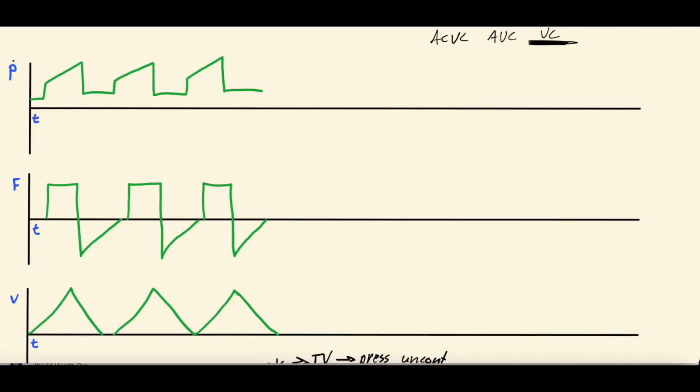The first one here is pressure versus time. So pressure on the y-axis, time on the x-axis. The second is flow over time. And the third is volume over time. And in volume control, the scalars you see are determined by how the ventilator is delivering the breath. All right? The volume scalar is the easiest to understand, so that's what we'll start with. So what you have with each breath, this is a single breath here. So this is one breath.